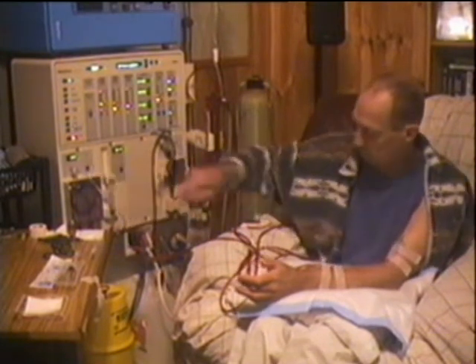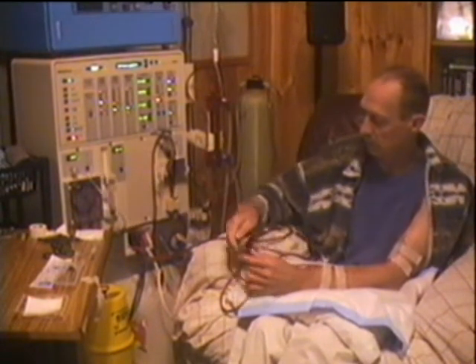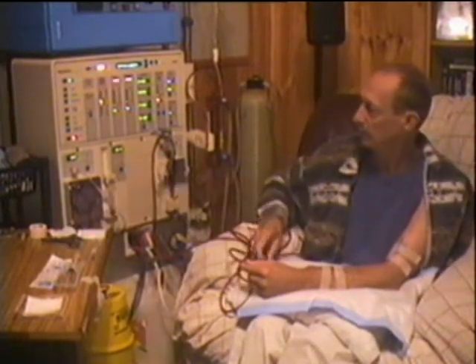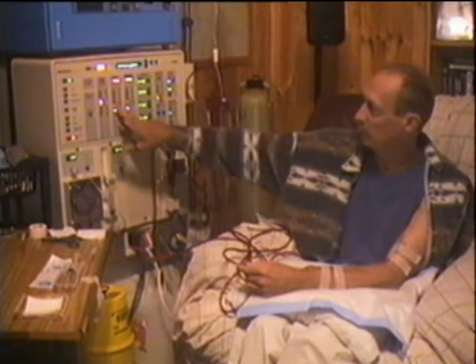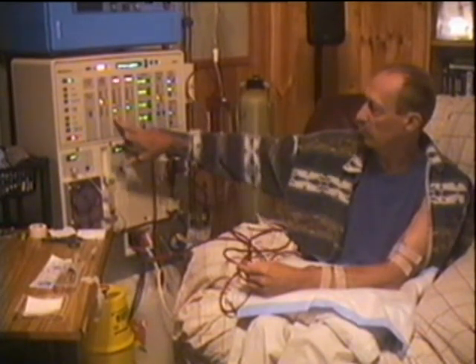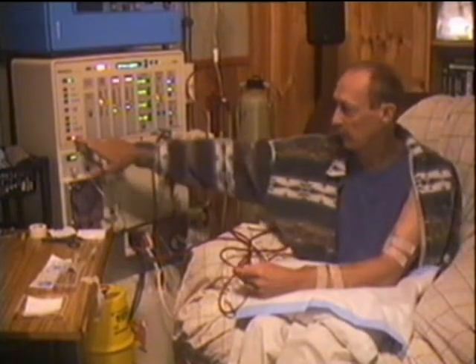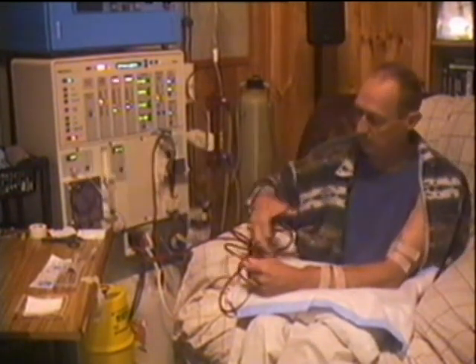Turn the machine off — stop the machine — and now an alarm will come on because the machine stopped. The machine's detected that there's no blood flowing, so it's telling me what's going on and setting an alarm. I know that because I've stopped.